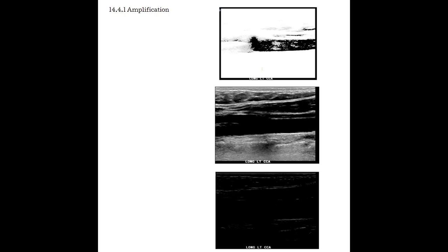But when we increase the gain, it does not pose any risks to the patient because we are not subjecting them to more ultrasound energy. We're just changing how the machine is displaying it. So in these three images here, the top image has a very overly gained image. Everything is super, super bright, including the noise. So remember that gain identically affects all the echoes. It's going to increase the brightness of all of them.